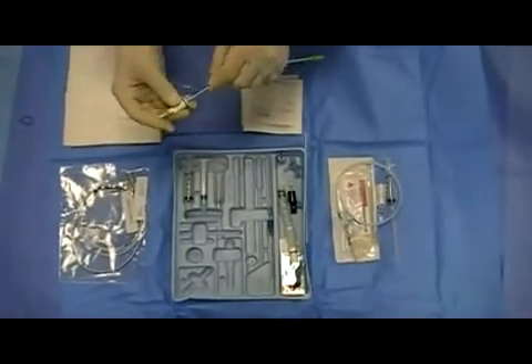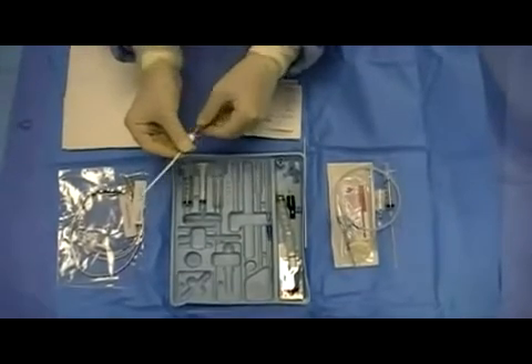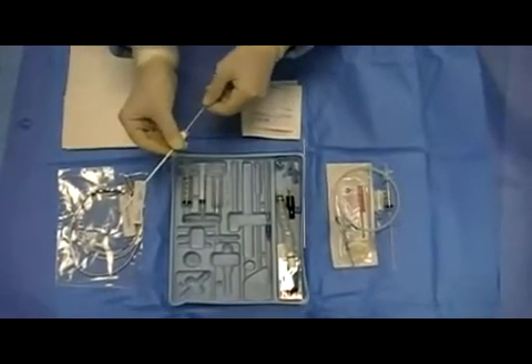Thread the dilator into the cordis catheter — it will be a snug fit. This step is important to perform before gaining venous access.